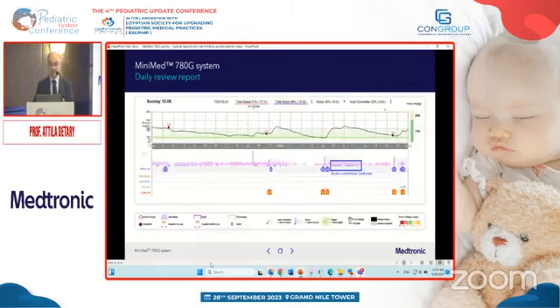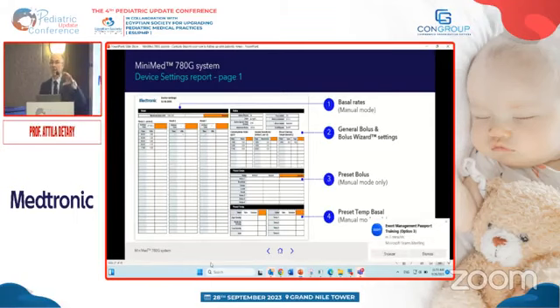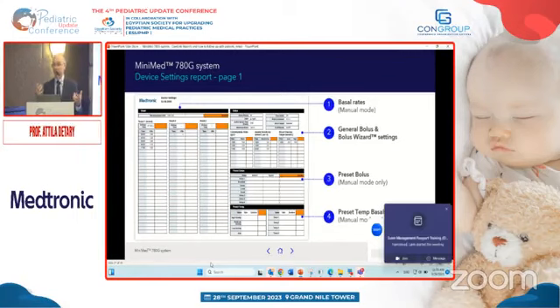These are the daily reports. And this is the settings. So if you want to see what are the current settings in the patient's pumps, you can check here. Okay. And again, remember what I told you at the beginning. So the crucial report is the assessment and progress, the first one or the first three. And then if it is not enough for your data interpretation, then you can go to the settings, to the daily reports or whatever, but you do not have to analyze all the reports.